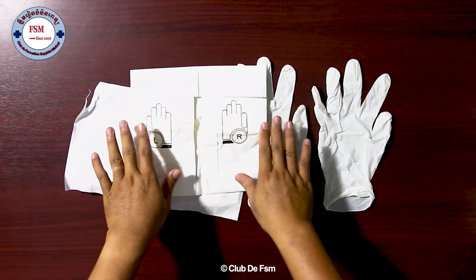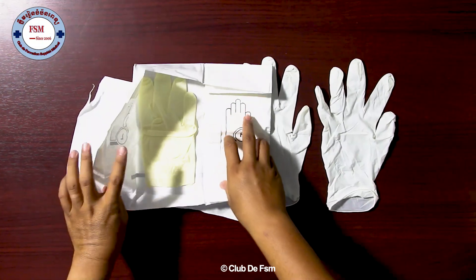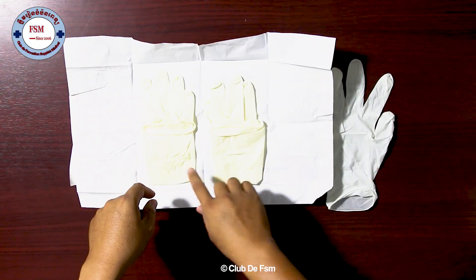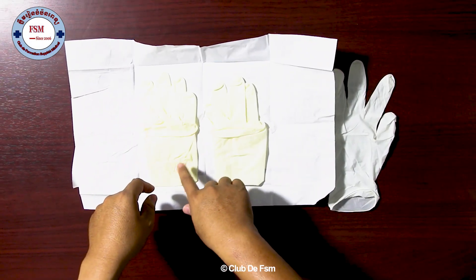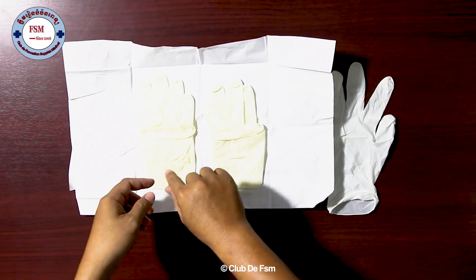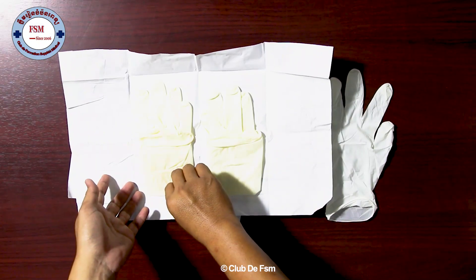Inside is a sterile zone. Outside is a non-sterile zone. We take it like that — it's left hand and right hand, sterile zone, all sterile zone. But we can put this because we put it inside. Outside is a non-sterile zone.